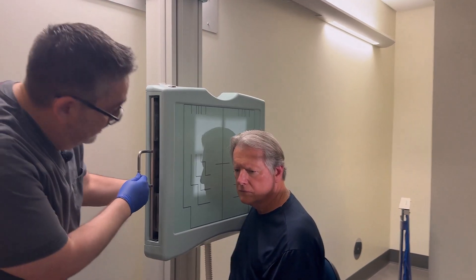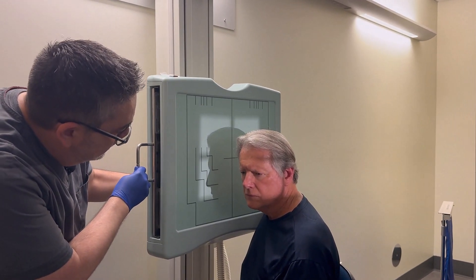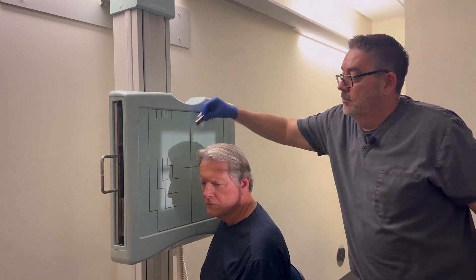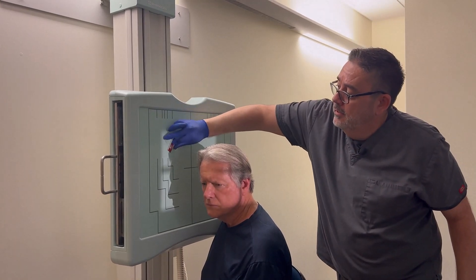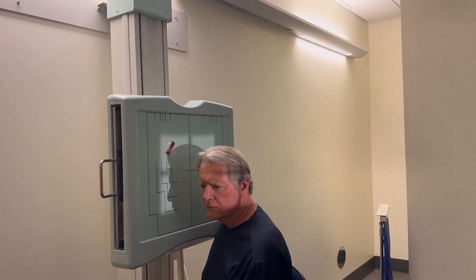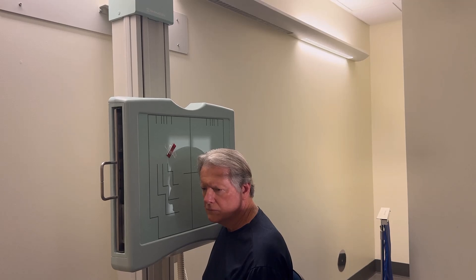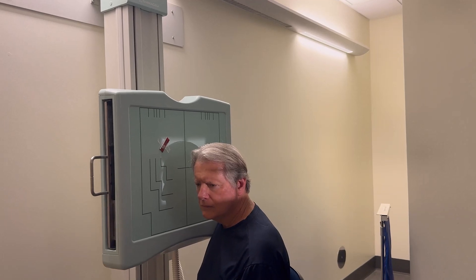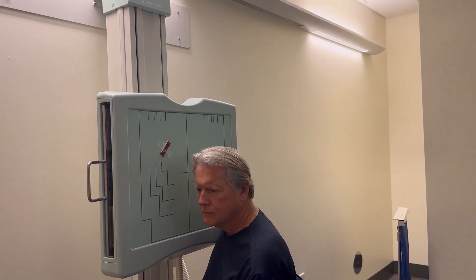Check my light again, and I'm going to line up my bucky now. I think we're good there. And because this is a right lateral, we're going to mark the anterior border here with the right marker. We can collimate a little — we need the frontal bone, the top of the skull, to the mastoids at the bottom. We can take this on suspended respiration and you can relax.